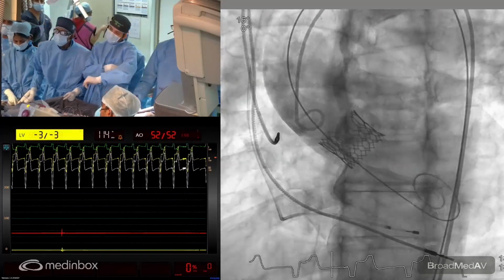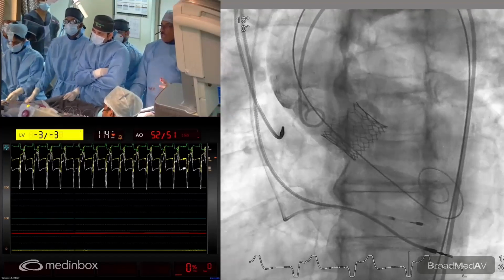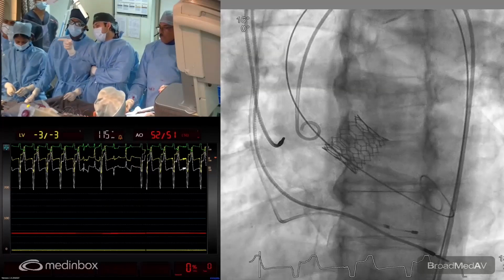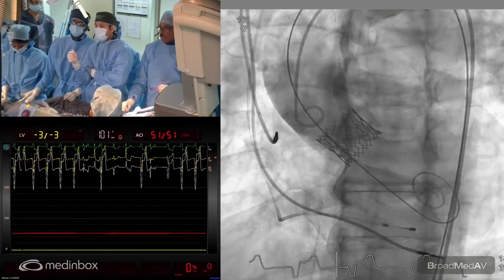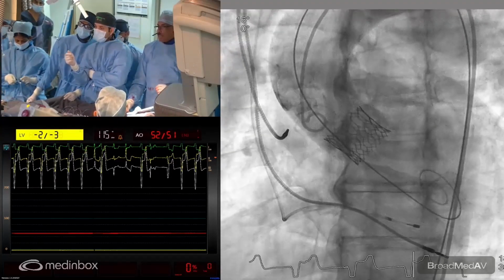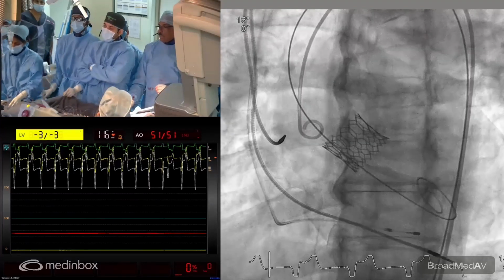It's a perfect valve, absolutely perfect valve implant. No coronary obstruction, coronaries are flowing. It's just an outflow obstruction because of a balloon expandable valve in a patient who has a very concentric left ventricle and who may get a VF. So I'm quite happy with this. The white line stops below the coronaries, which are flowing well. What do you think, Ashish?